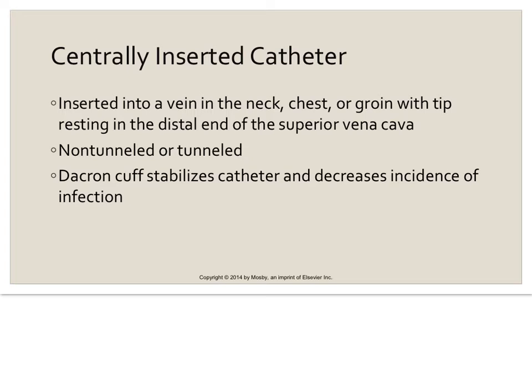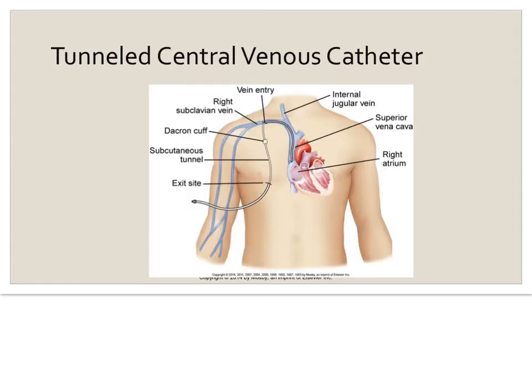The main point on this slide is some catheters are considered non-tunneled and others are considered tunneled. So we're going to talk about non-tunneled versus tunneled as we go through these slides. Okay, this is an example of what we call a tunneled catheter. This picture is also in your book on page 310. What I want you to realize is, you can see right here, I'm circling the exit site. So all of this right here is actually under the patient's skin. You do not see it. So that's why it's considered a tunneled catheter.